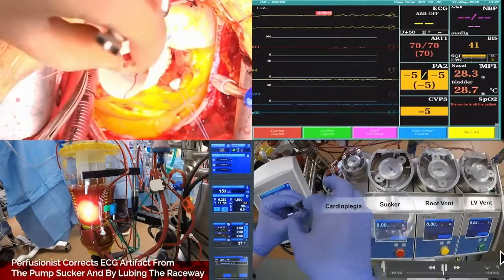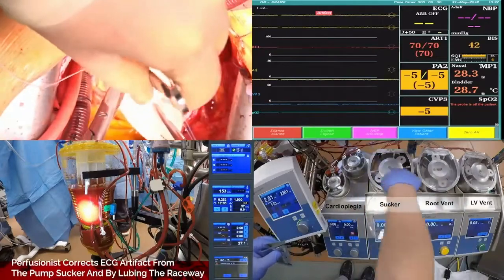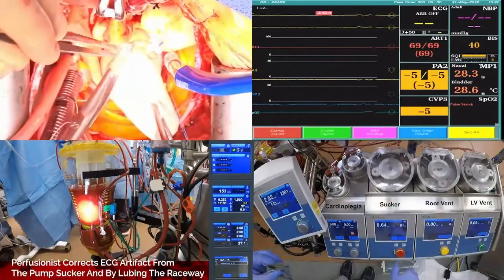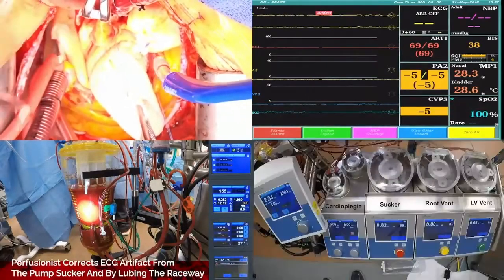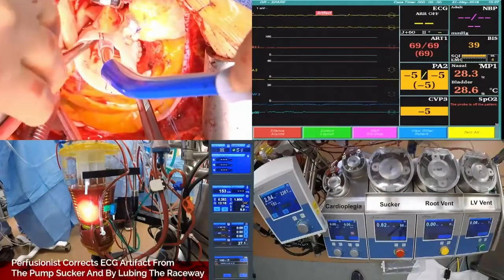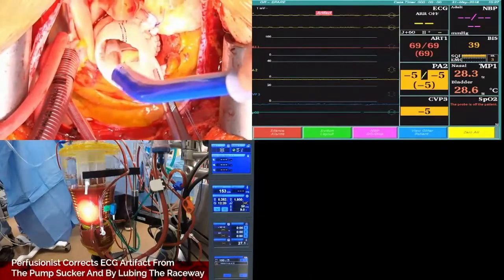Okay. I think this is the first lube event. I just want to watch it again, all right? Can I just be entertained? Now watch it. Just watch it. It works. Yeah, it does work, but the consequences. Oh, come on. Watch the tube. Watch the pump. See, you're trying to use the pump sucker. Mike, that's the pump sucker in your hand, okay?